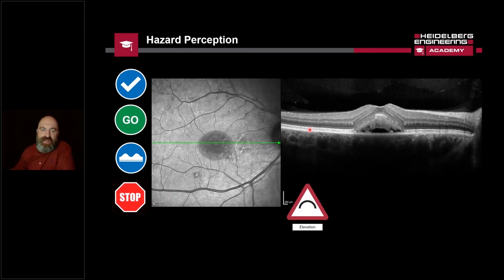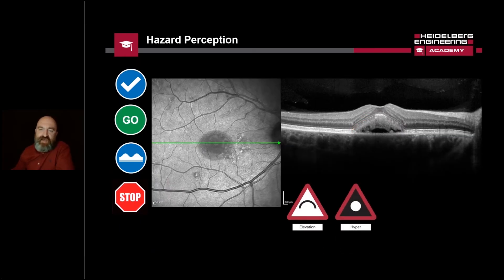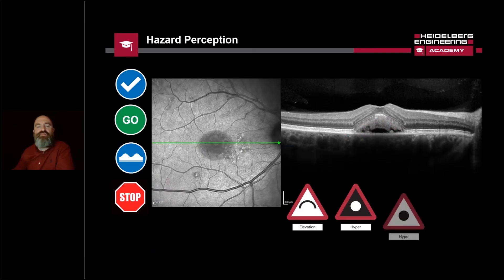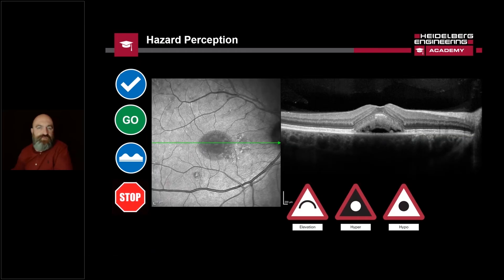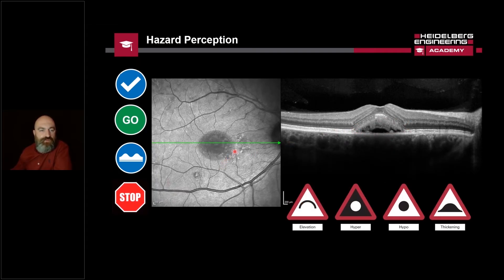We're going to stop at this point and now use our iWay Code symbols to describe what we actually see in this B-scan without even having the diagnosis. The first hazard we're seeing is elevation — this is quite clearly proposing the idea that this elevated part of the photoreceptor layer is irregular. The second hazard is hyperreflection — we can see bright material on that B-scan that we don't see on a normal scan. But underneath that we can also see hyporeflection — in this part of the retina underneath the outer limiting membrane, that is of course subretinal fluid. In a primary care setting, that would almost be an instant referral. And because we've got these three things happening, we do indeed have thickening — which coincides with our infrared image where there's a blister of subretinal fluid right at the fovea.